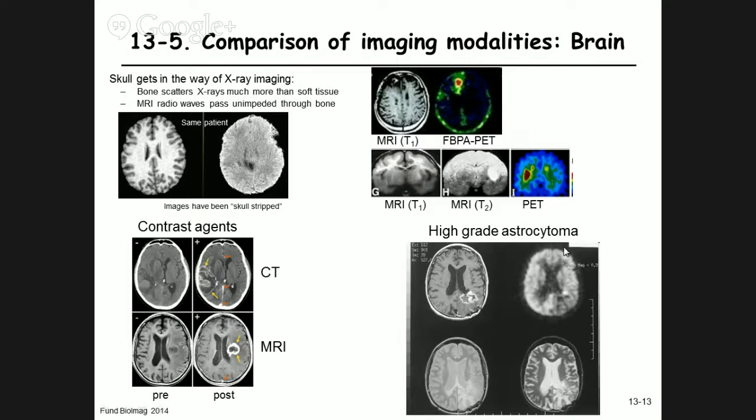How about this image? What modality is that? Any guesses? Is this an MRI? Actually, could be. You could generate a contrast that looks similar, but I will tell you it's a fairly standard contrast. Is it a CT image? Yes? No?